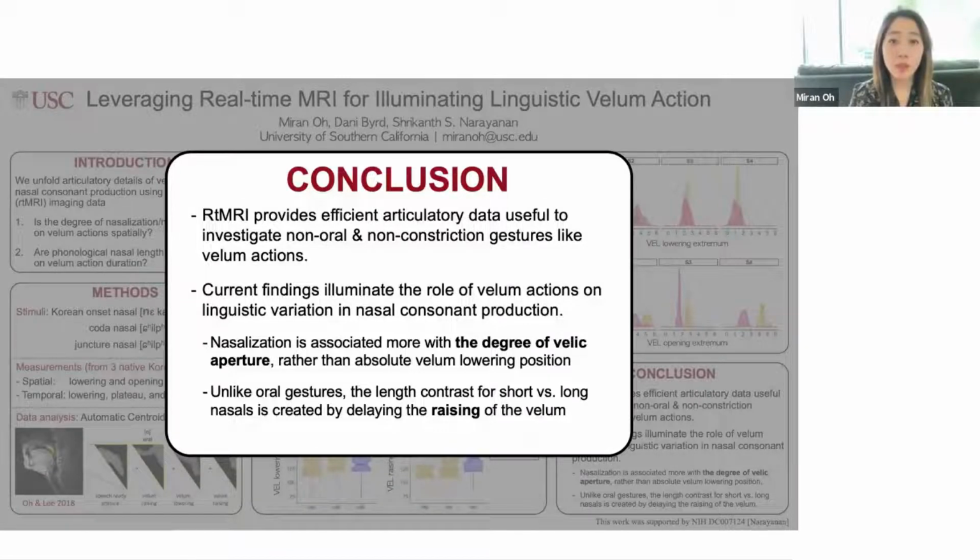This work further demonstrates the utility and efficiency of real-time MRI as an instrumental tool for studying human speech production. Dynamic MRI particularly allows for a unique window onto understanding kinematics of non-oral and non-constriction speech gestures, such as velum gestures.